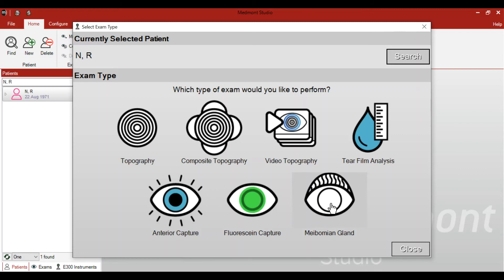With the Medmont Meridia, there are many different options available: assessing corneal topography shape, evaluating tear film quality, understanding the cornea and sclera in white light, assessing fluorescein patterns of contact lenses, understanding staining of the conjunctival or epithelial surface, and assessing the meibomian glands. These various tests make the Medmont Meridia a multi-function tool for a wide variety of applications in your practice.